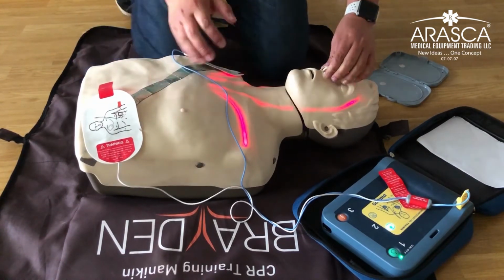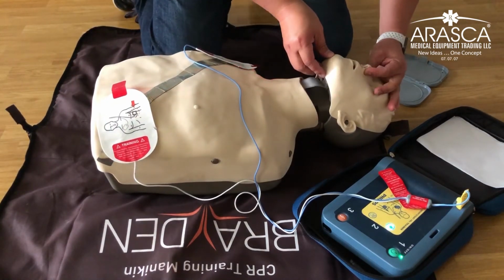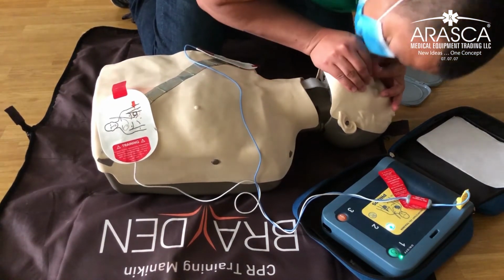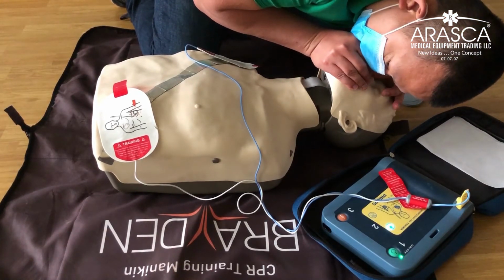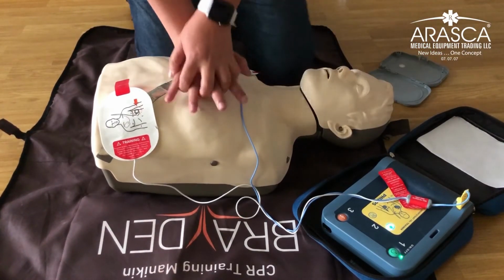Pinch nose, tilt head, lift chin, and give 2 full breaths. Breathe. Breathe. Continue with compression.